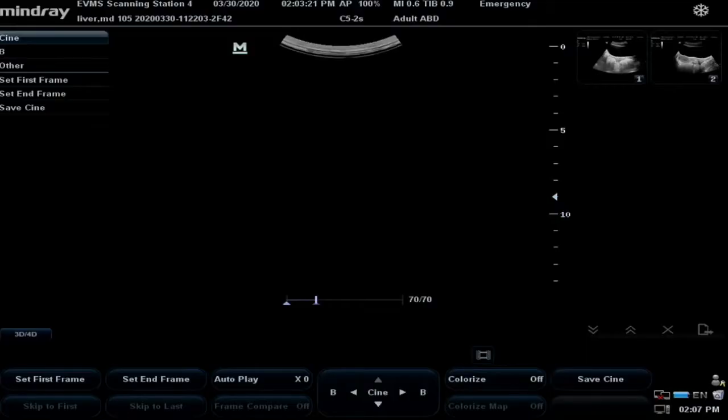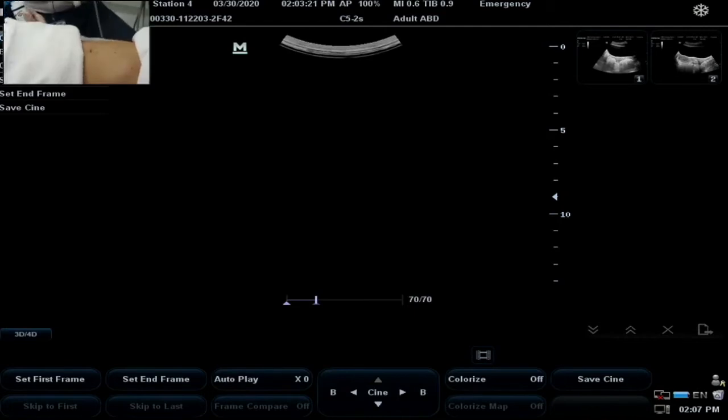Okay. All right, now I'm going to put some gel on our patient.